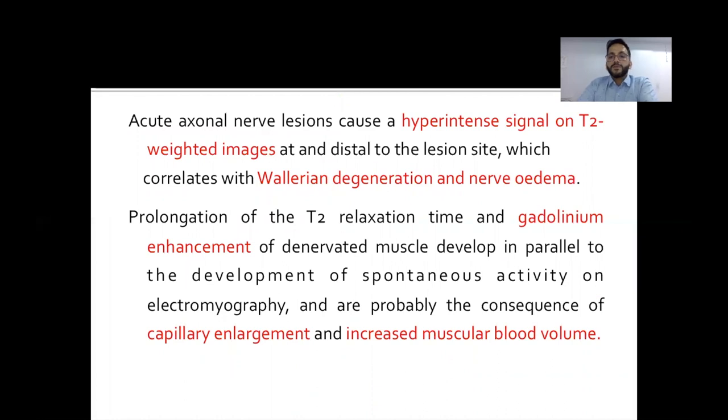The acute axonal nerve lesions cause a T2 hyperintense signal at a distal to lesion site. This correlates with Wallerian degeneration and nerve edema, prolongation of the T2 relaxation time and gadolinium enhancement of denervated muscle developed in parallel to the development of spontaneous activity on EMG. And these are the consequences of capillary enlargement and increased muscular blood volume.